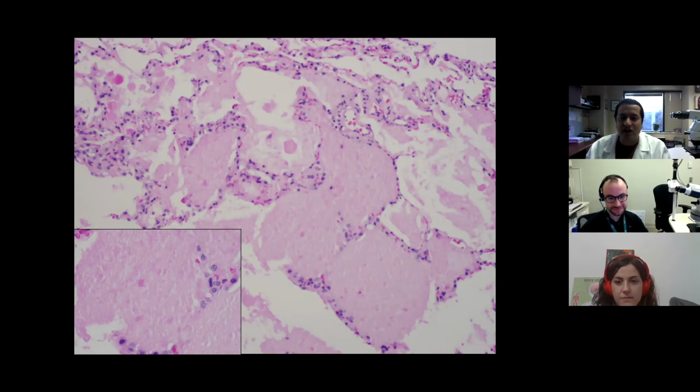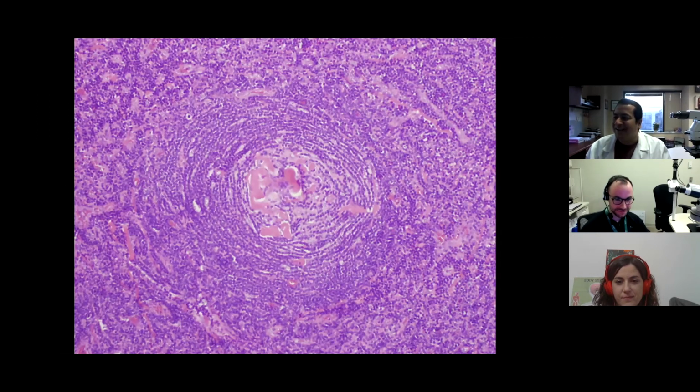Okay, guys, great job. This is not quite lung pathology, but I thought I'd throw this in there. Let me give you a stem. This is a 45-year-old woman with lots of autoimmune problems, anemia, thrombocytopenia, and a big mediastinal mass. Nothing in the lung, just a big mediastinal mass. Flow cytometry was negative. Clonal studies were all negative. There's no evidence of malignancy. But she has these autoimmune problems, anemia, and this mediastinal mass.